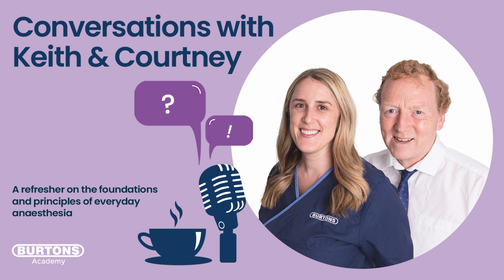And I think the important thing is when we move our patient from one theatre to the next, and perhaps it's a different circle system, you have to do the same thing all over again. Perhaps the patient was only just in there and that system is still filled with this really high concentration of oxygen. But if in doubt, if I can't measure the levels of oxygen with an oxygen analyzer, I just turn it up for 10, 15 minutes, and then I turn it back down again. So we're just needing to push out that room air and fill it all up again.